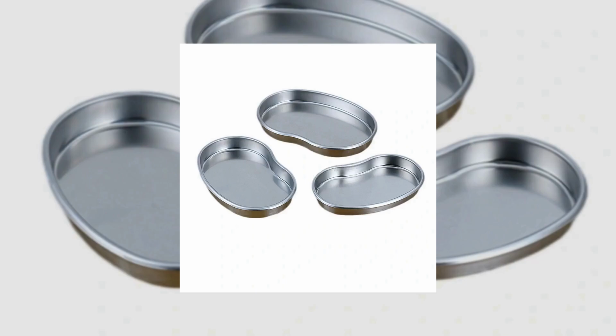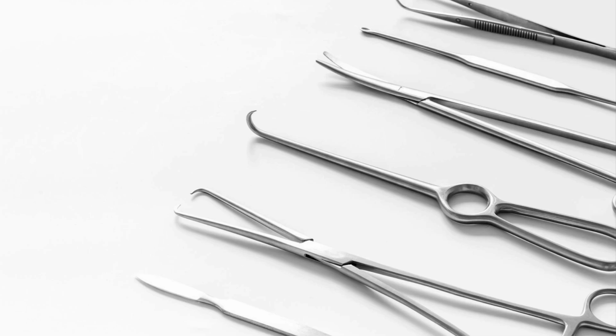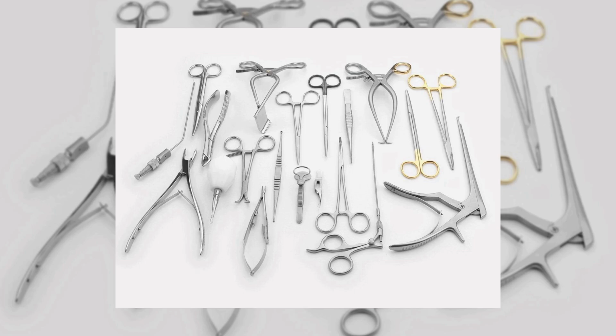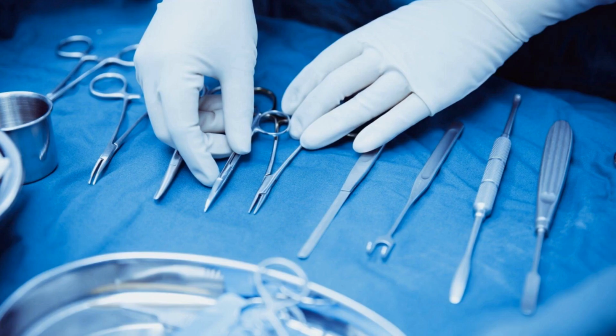3. Materials used in surgical instruments. Common materials. Stainless steel, explain why it's commonly used. Durability, resistance to rust, etc. Titanium, lighter and more durable, often used in specialized instruments. Why material matters. Importance of choosing the right material for different surgical contexts.